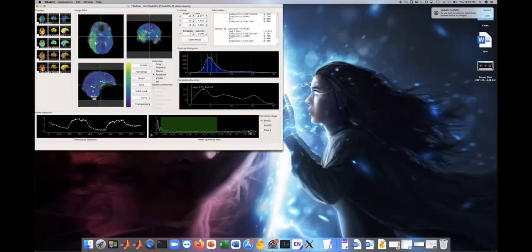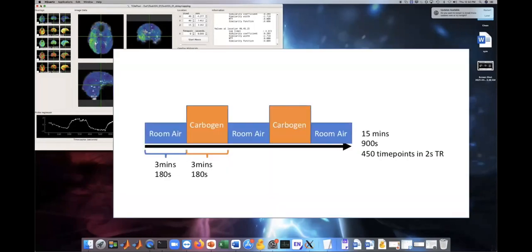Lastly, and very importantly, we should always look at the regressor. If you look between the prefiltered, which is the initial estimate, and the pass 1 estimate of the regressor, there's a huge difference which is based on the filter we used, which you see in the shaded green area here. So if we blindly use software, we might miss some important parts of the data. The reason here is that the subject underwent a carbon dioxide challenge, which you beautifully see in the prefiltered data, but which isn't used at all in our regressor since it's at 1 divided by 360 seconds, so 0.0027 Hertz.